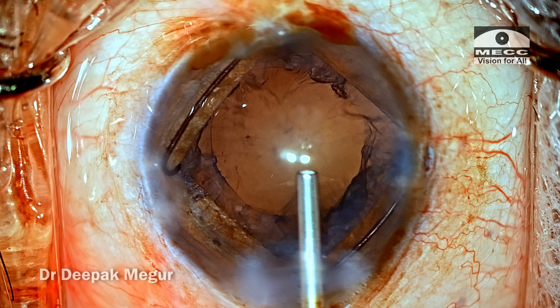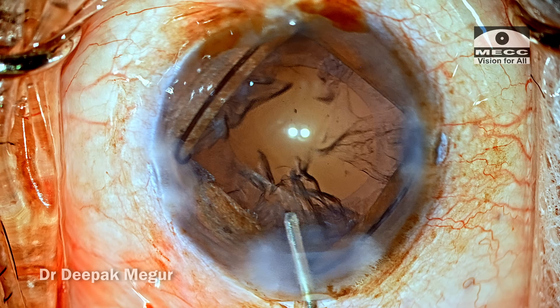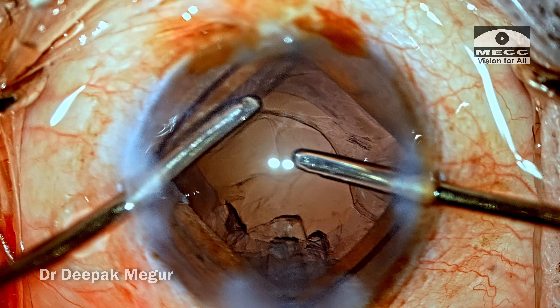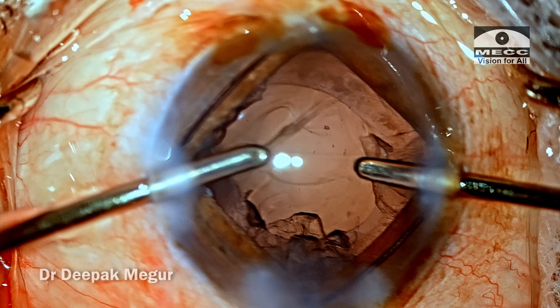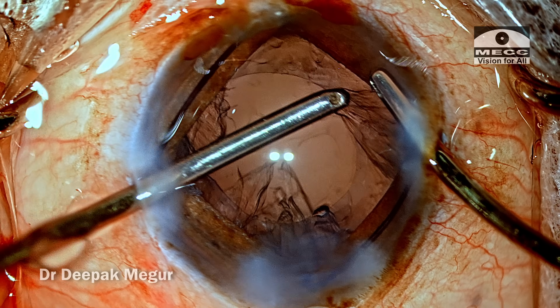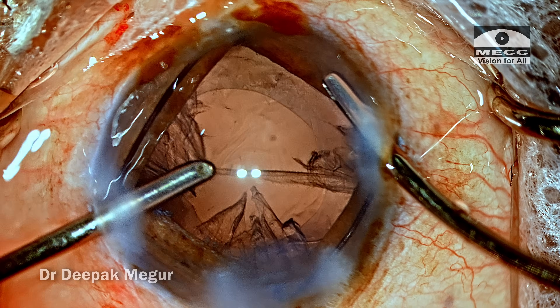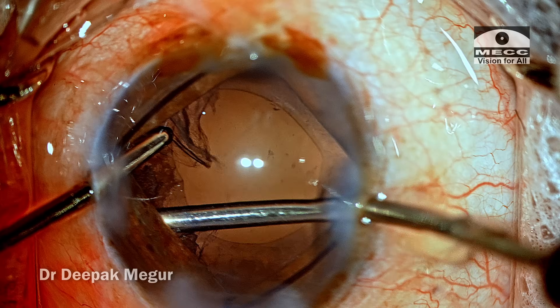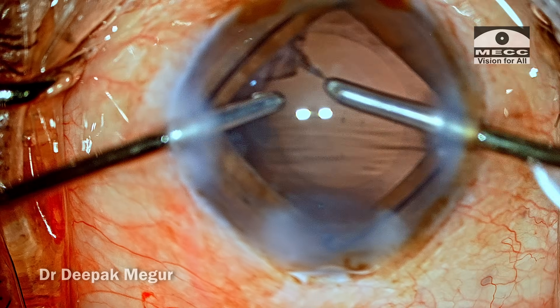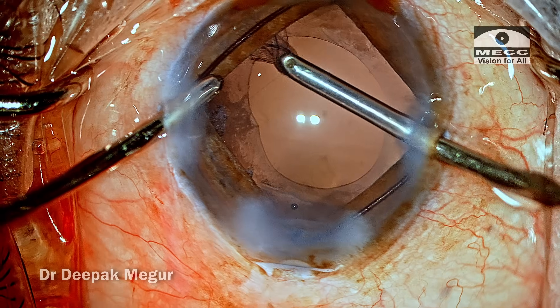Coming up to this step was the more challenging part. One needs to be very careful during cortex aspiration. Since the zonules are very weak and the barrier is not very effective, there is always a risk of fluid from the irrigation going across the zonules into the Berger space and pushing the posterior capsule up, leaving insufficient space in the capsule fornix when trying to negotiate the cortex out. If the radial way of extraction is not helping, always resort to the tangential way of removing the cortex — move the aspirating cannula tangentially across and you will find cortex removal much easier, especially with the CTR in. Be mindful of the risk of catching the anterior capsule as well, staying just a few microns below it.